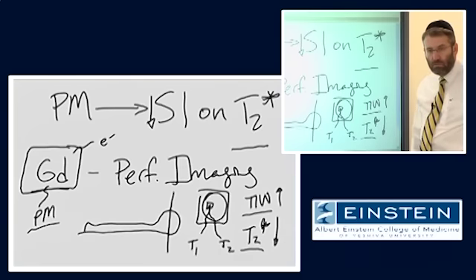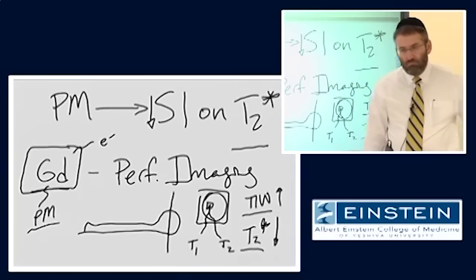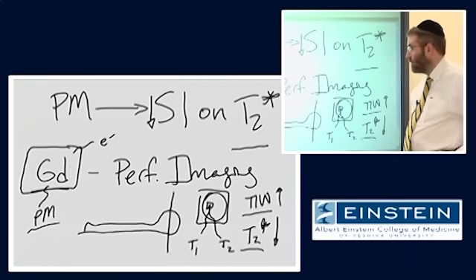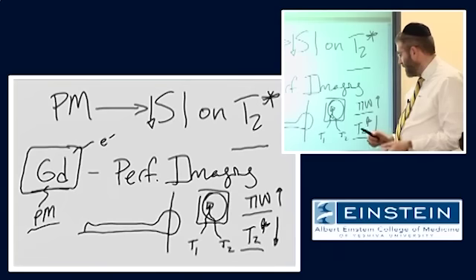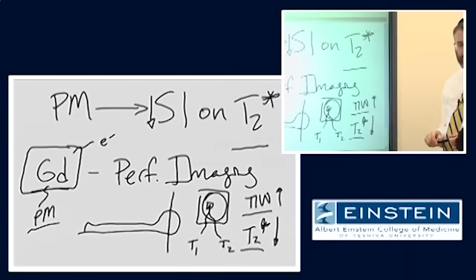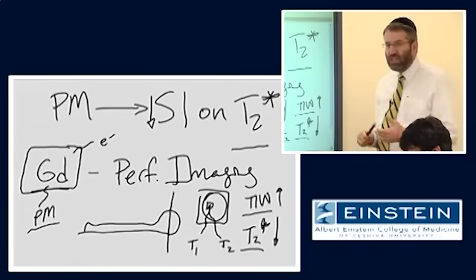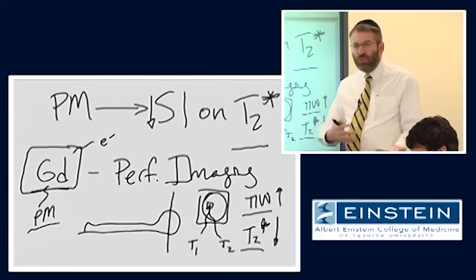Question? Yeah. Didn't you say that it had to be localized when we're talking about the iron, and the difference between whether it was diffuse or whether it was actually creating? Okay. So, true. How would you apply that concept to gadolinium? Well, what I would say is that what determines, within that little volume of tissue, the distribution of the gadolinium contrast agent? We inject it intravascularly. Right? Different amounts are going to go to different parts of tissue.